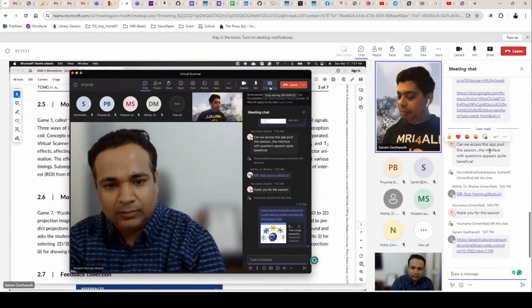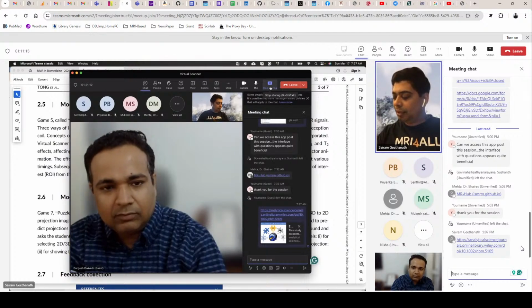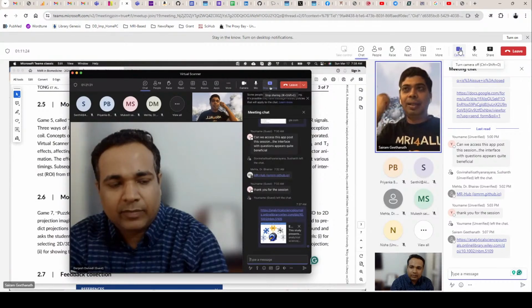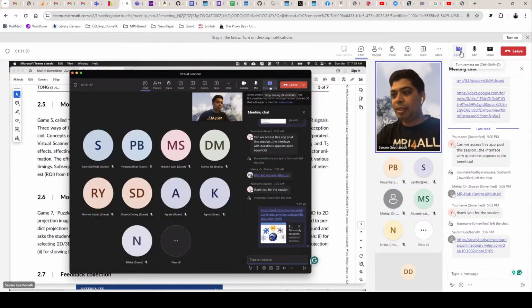And of course, in another setting where the internet is not accessible enough, you can imagine that the students are actually playing by themselves, getting from 0 to 1.5, and then they can interact with experts to make sure that the concepts they understand make sense. And we link it up to MRI question and answers for further definitions as well.